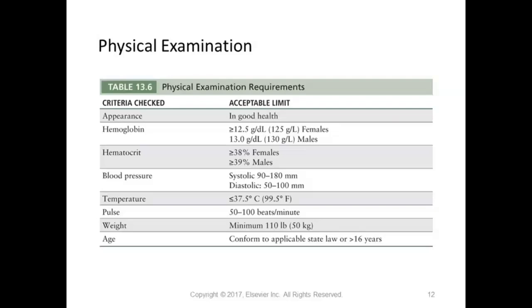So donors weighing a minimum of 110 pounds can tolerate a maximum withdrawal of 525 milliliters. Donors weighing less are not restricted. So in all honesty, if you weigh less than 110 pounds, you should not be rejected, but less blood should be removed. And then the maximum withdrawal for someone less than 110 pounds would be 473 ml.